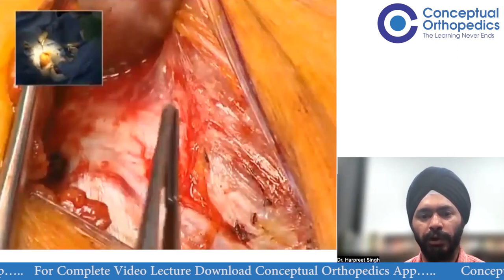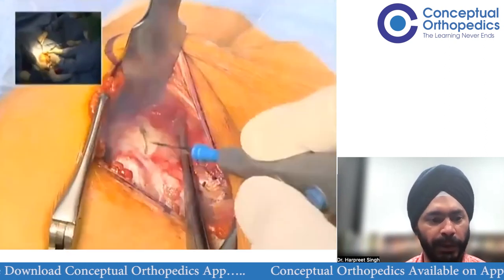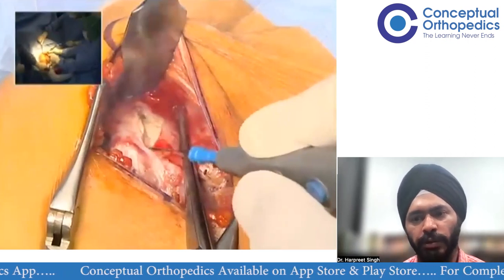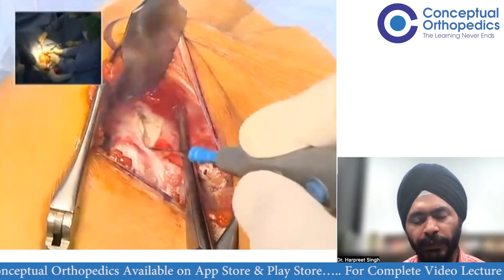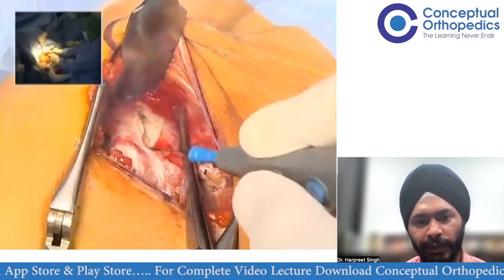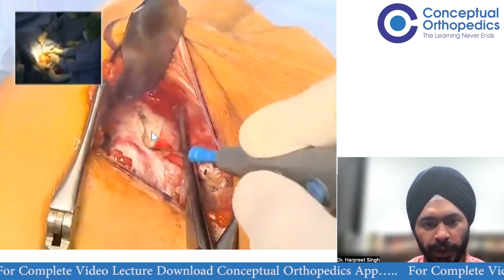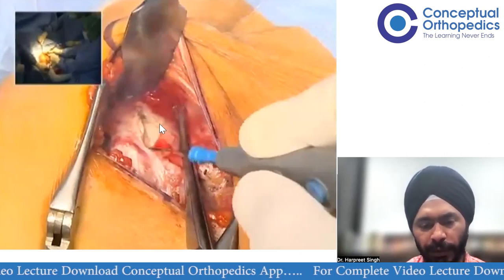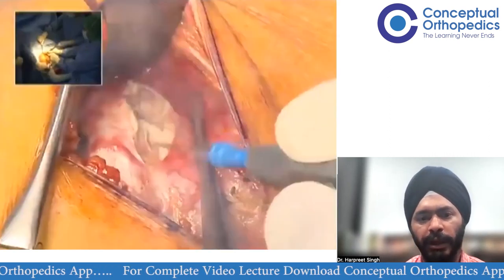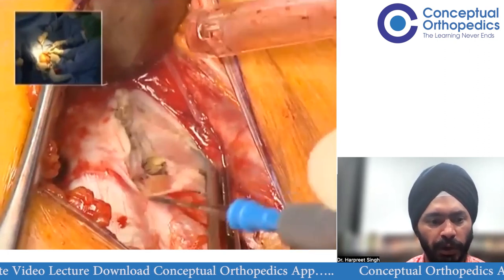Going more medially now, you want to find the interval between the conjoint tendon and the pec minor. On the medial side, removing the superficial soft tissue, you usually find a cleavage of fat that separates the conjoint tendon — going straight down — from the pec minor going medially. Dissect in that fat plane and remove the pec minor from the coracoid process.